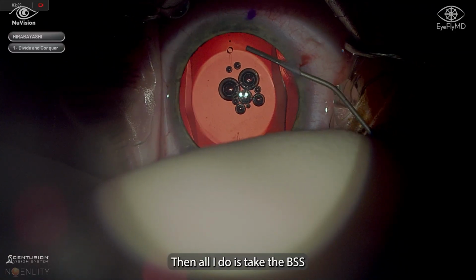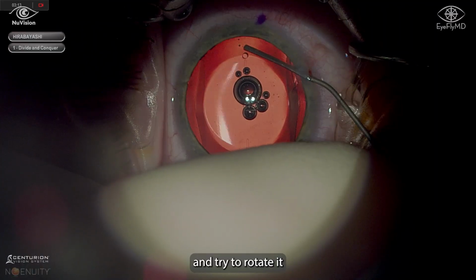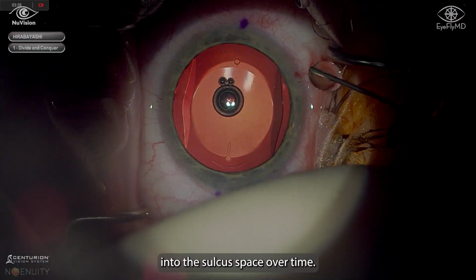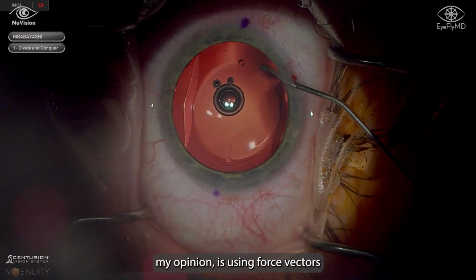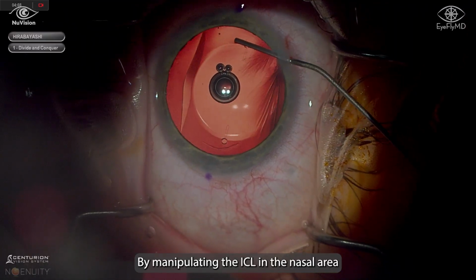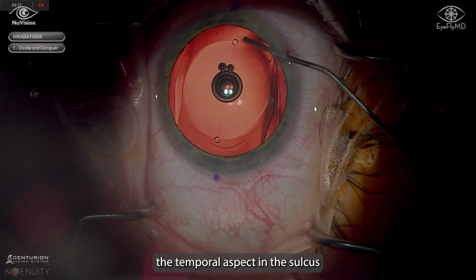Then all I do is take the BSS cannula, and first you can nudge it around and try to rotate it, and that frees it from the sulcus space. It really does settle into the sulcus space over time. Now, the real magic trick, in my opinion, is using force vectors to your advantage. By manipulating the ICL in the nasal area, we lift up here and it actually frees the temporal aspect in the sulcus to allow it to spin.